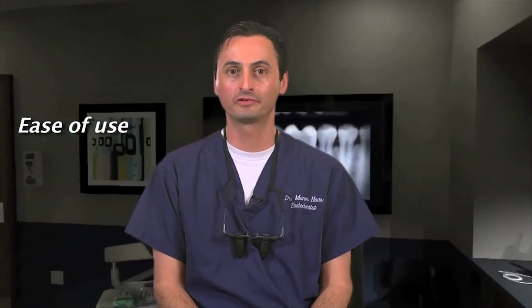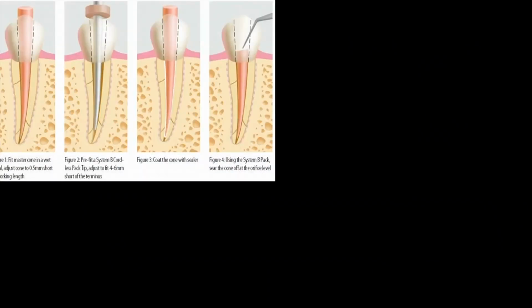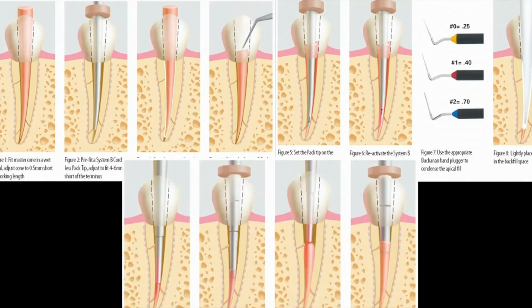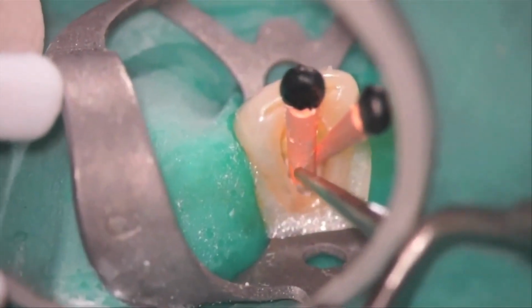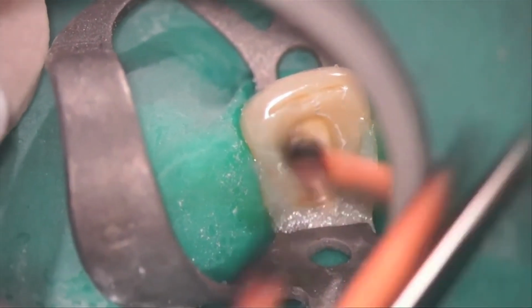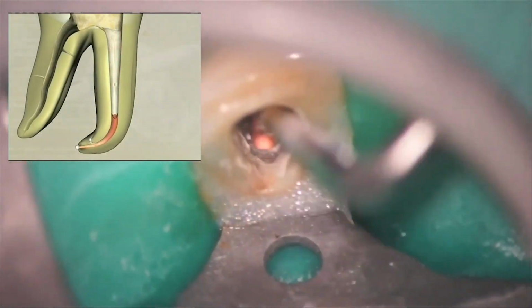Another misconception is that using GuttaCore is more difficult than traditional warm vertical obturation. This couldn't be further from the truth. For instance, traditional warm vertical downpack obturation techniques require far more steps and are much more technique sensitive. I'm really oversimplifying it, but they would require the following: a master gutta percha cone, searing off the cone, and backfilling the canal. These are, in my opinion, far more difficult to perform and perfect than using a short and warmed gutta percha point on a carrier.